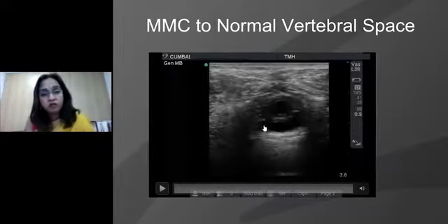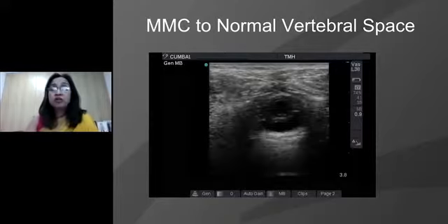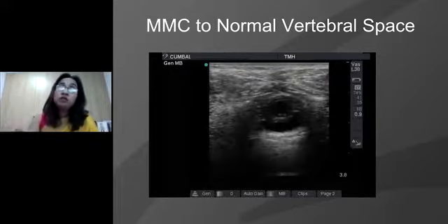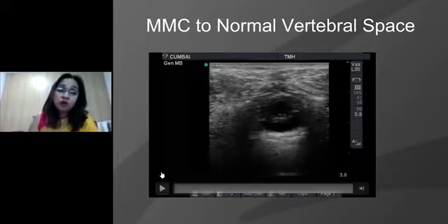If we really come across difficult cases such as operated meningomyelocele, well, a caution here is it still remains a very delicate job to do. But suppose the risk-benefit ratio does drop towards having a central neuraxial block in these particular patients, such as bilateral foot or hip or intra-abdominal major surgeries where analgesia is pretty important, then what we can do is choose a well-formed vertebra with a normal osseous architecture and work in that most normal looking intervertebral space, sparing the vertebral spaces where the scarring and damage has occurred.